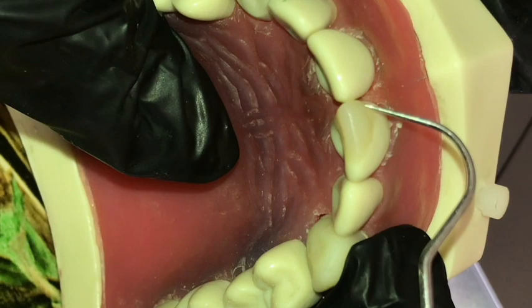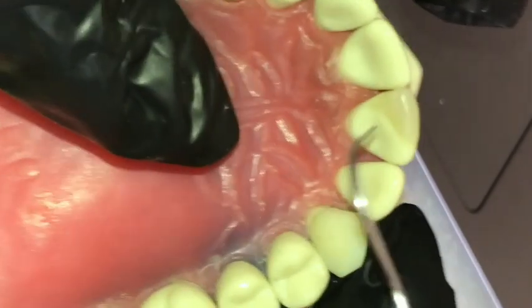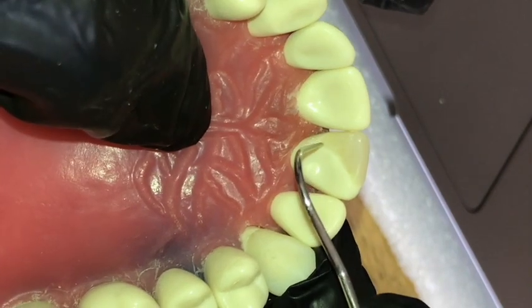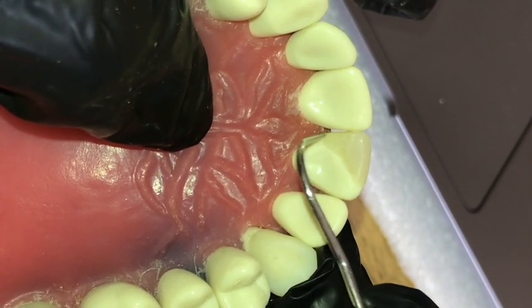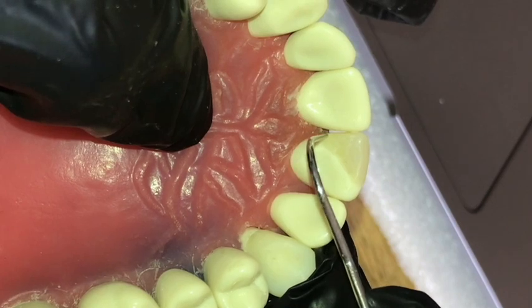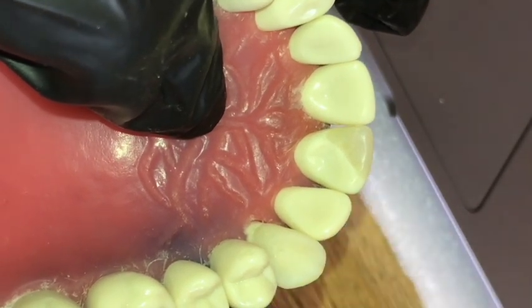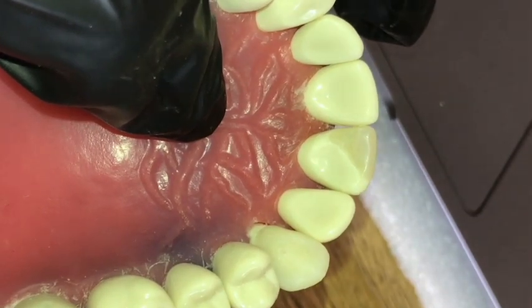Of course, you can check with the probe whether there are any excess or deficiencies by running the probe across the cavosurface margin. So any overhangs up here you can also catch with the probe, or sometimes when you floss it, the floss gets shredded there. And obviously there shouldn't be any bubbles, clefts, and whatsoever. Thank you.